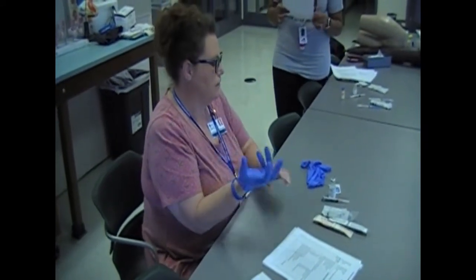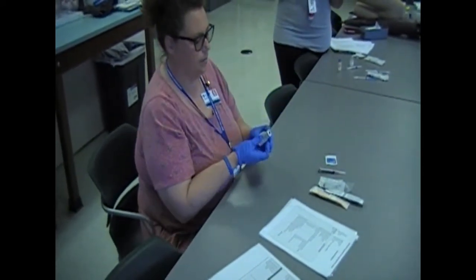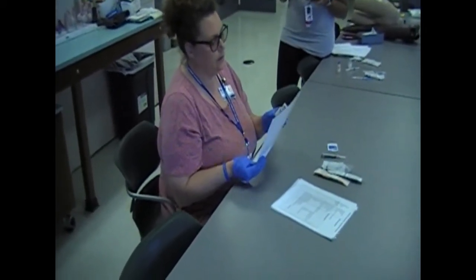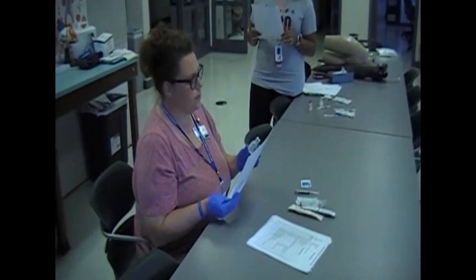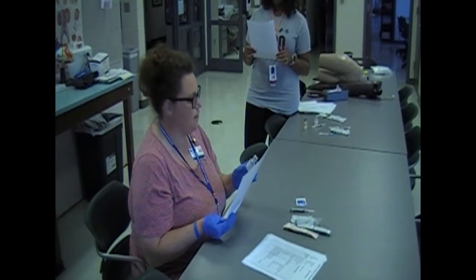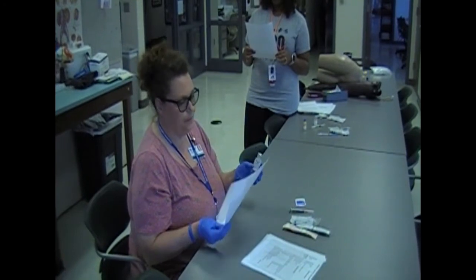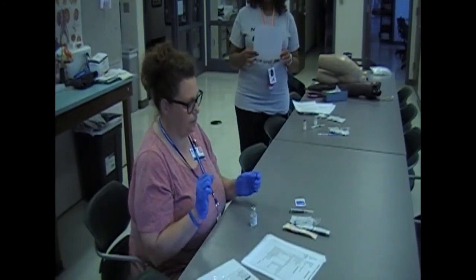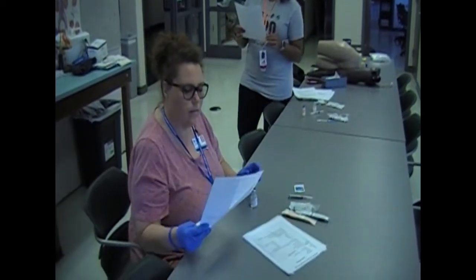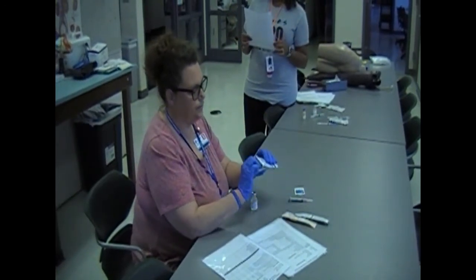So for our first med check, she is going to remove her med from the bag and then verify it against her MAR. Make sure you verbalize expiration date is good. Okay, so I have ondansetron, 4 milligrams, every 4 hours PRN for nausea and vomiting, Zofran, ondansetron, and my expiration date is good. Then second med check. You have to select the correct needle and the correct syringe for this administration. And again, verbalize your expiration dates.